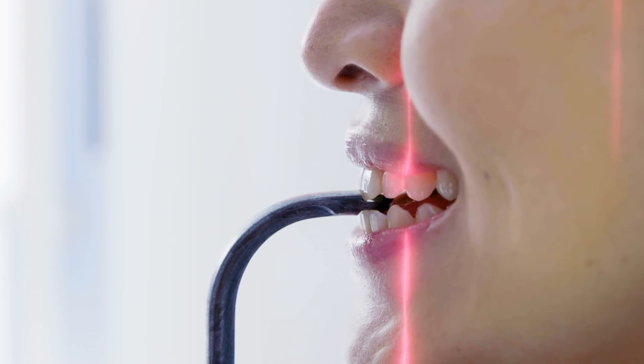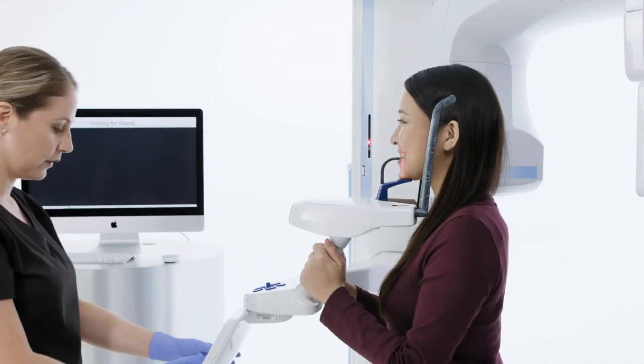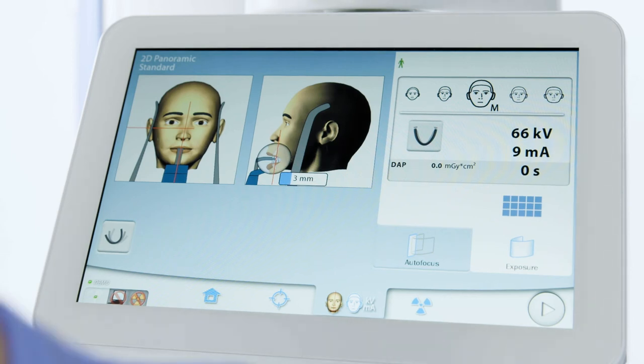It is meant to intersect the apical region of the upper and lower central incisors. Press forward to continue and instruct the patient to remain still, close the lips, swallow, and suction the tongue to the roof of the mouth.